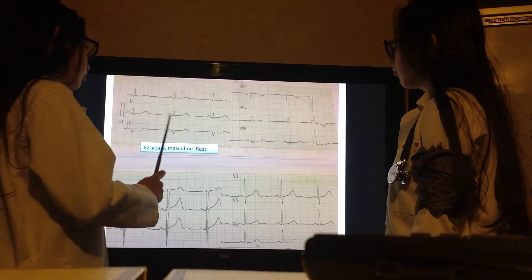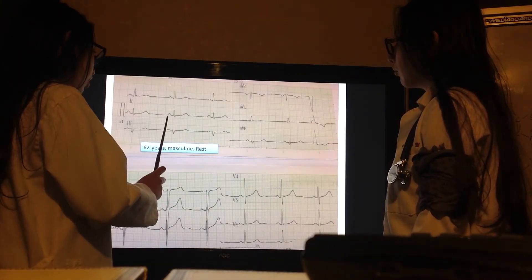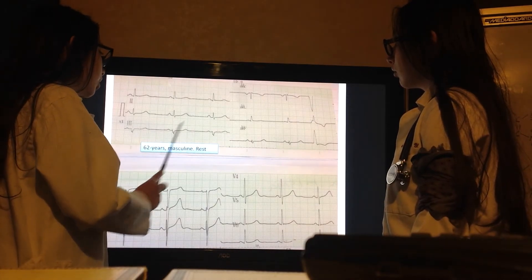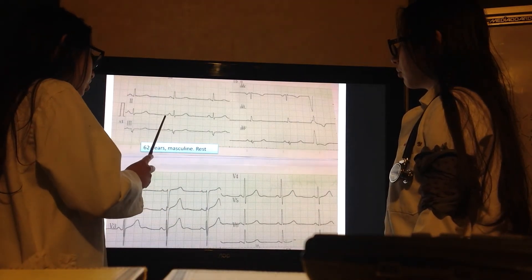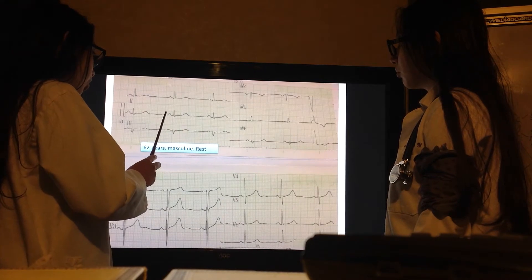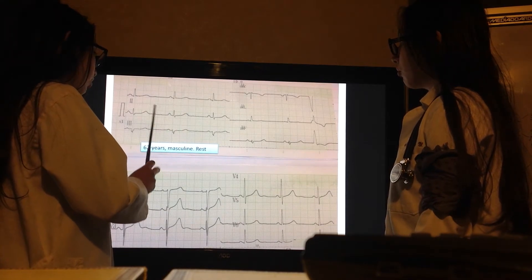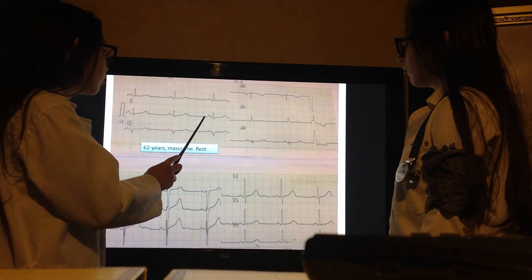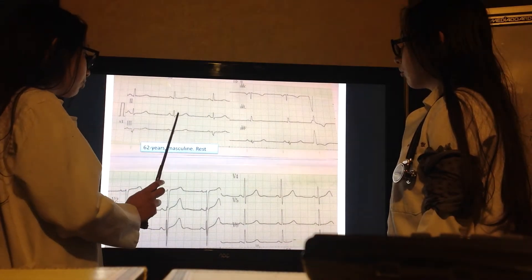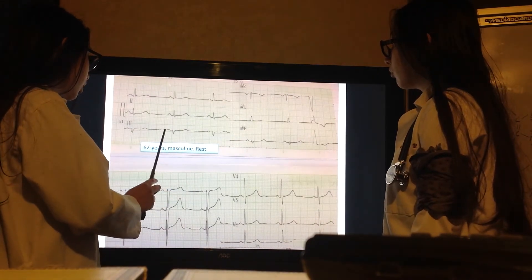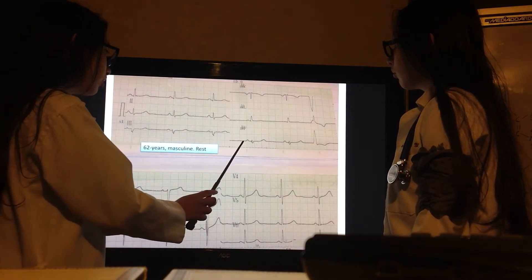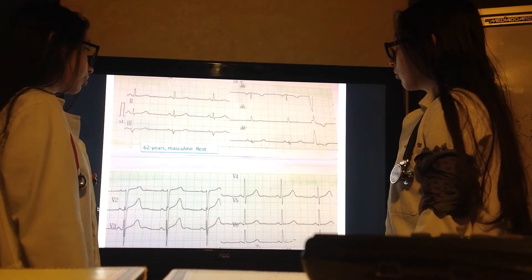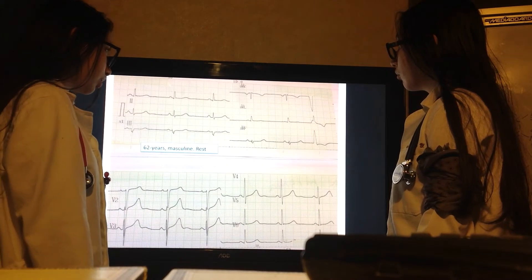Right atrial hypertrophy is assessed by the P wave in D2, D3, and AVF, which has to be smaller than 0.25 millivolts. Here it is like 0.15 to 0.2, here like 0.1, and here also like 0.1. So there is no right atrial hypertrophy.